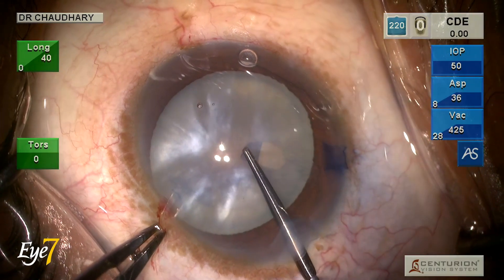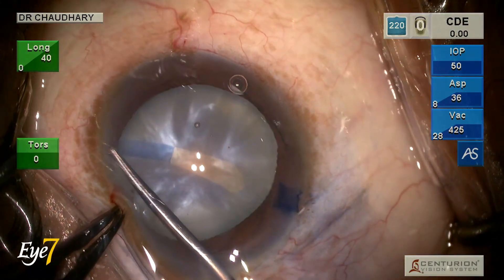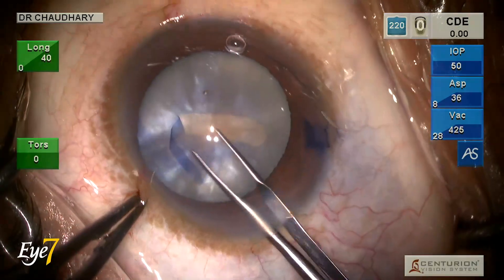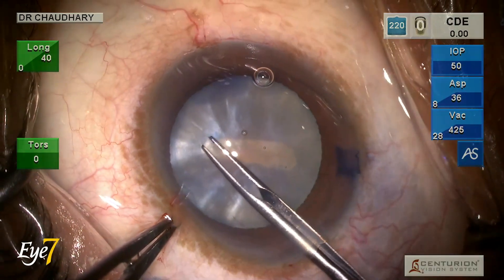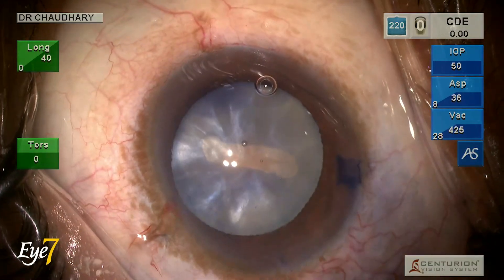Using this base-in nick as a hinge, a small flap is raised and a strip of about 3–4 mm is fashioned on the anterior capsule. Any loose capsular tags are rounded off by the surgeon, and as can be seen, a rectangular opening is formed in the capsule.